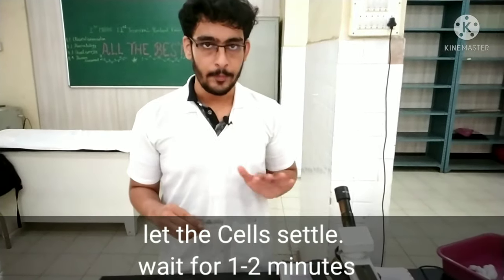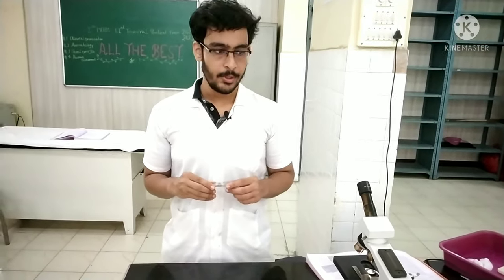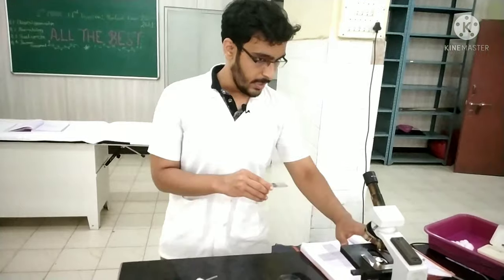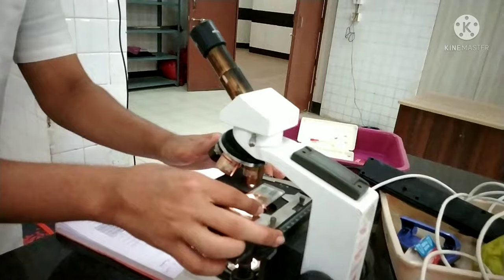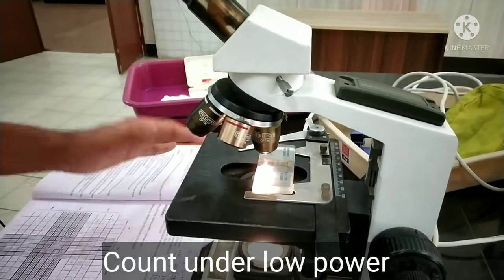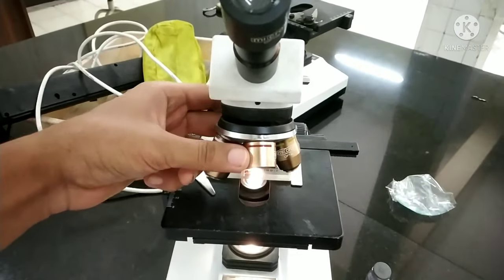Now let the slide settle for 1 to 2 minutes. After charging the Neubauer chamber and waiting for 1 to 2 minutes, place the Neubauer chamber on the microscope. Then to count, use a 10x microscope lens.